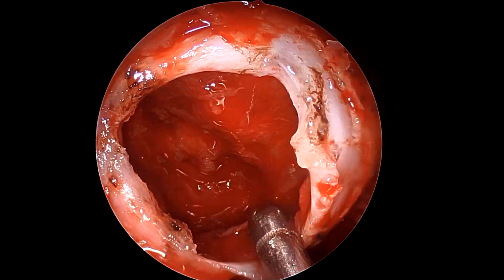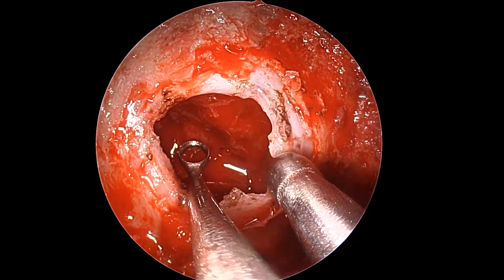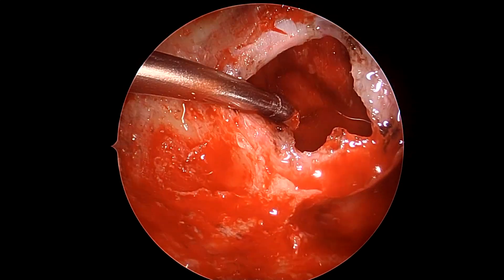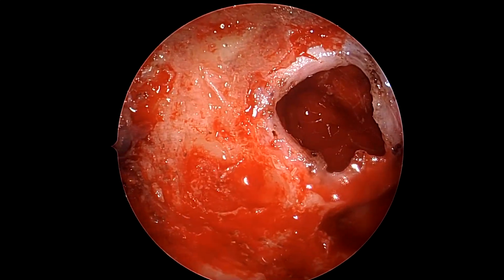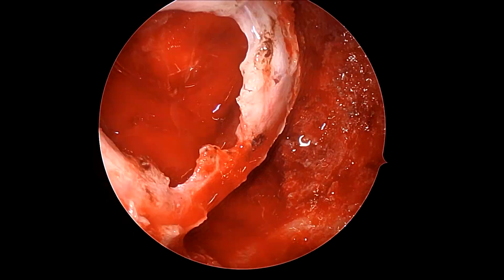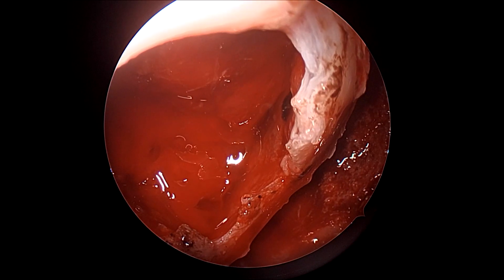Since our goal is to more or less not do a complete removal in this kind of case, we would rather keep the sphenoid as such, and not decrease it a lot, because that helps us get a better closure with our fascia and fat strip.